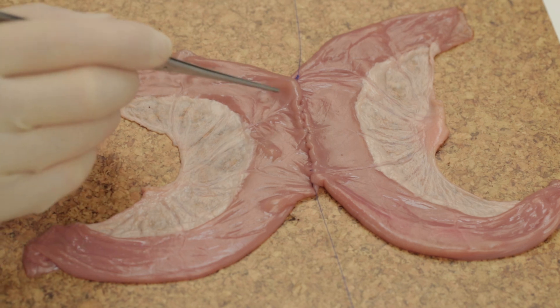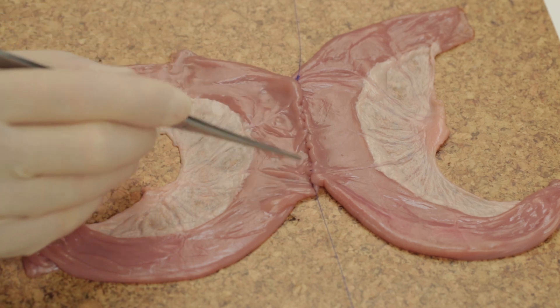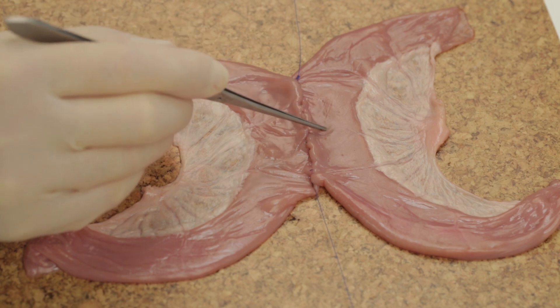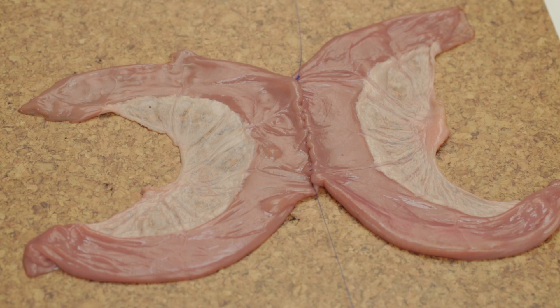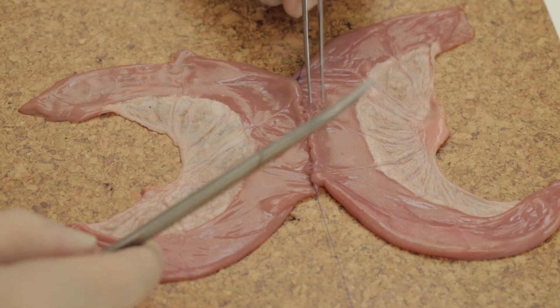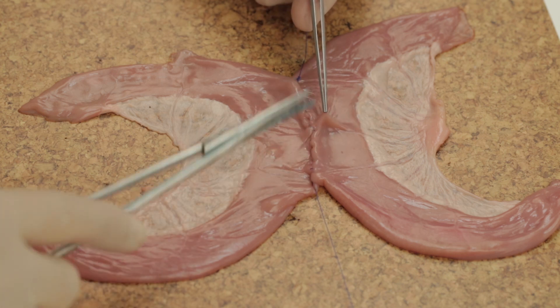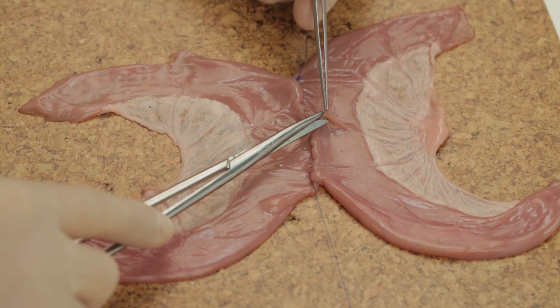Now the bowel must be incised. One advantage of this technique compared to, for example, an end-to-end anastomosis is that the incisions can be made exactly congruous. In vivo the bowel can be opened with cutting diathermy, but here I am using dissecting scissors. Whichever technique is used, ensure that you only incise the anterior wall of the bowel and do not cut through and through.